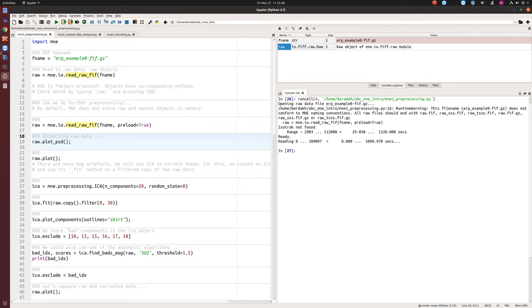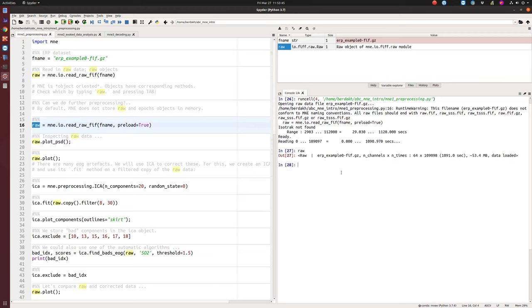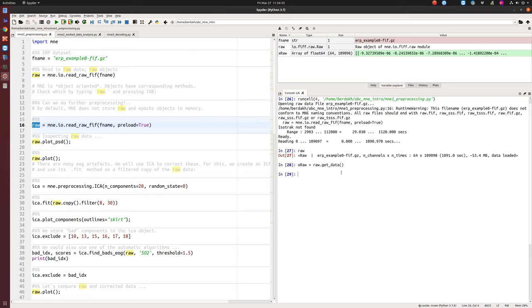With preload=True, you have access to the raw data. MNE is built on top of NumPy, so our data is a NumPy ndarray. Everything, every data is an ndarray. To get our data, we call raw.get_data(), which returns a NumPy array. Looking at xraw.shape, we see we have 64 channels, and the second dimension corresponds to the continuous time series.